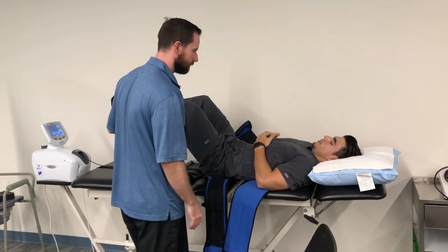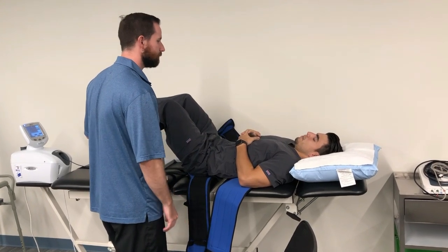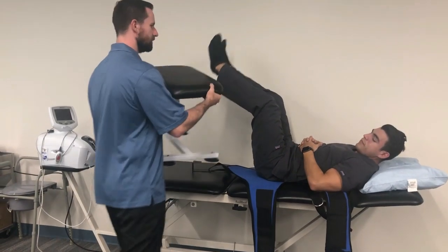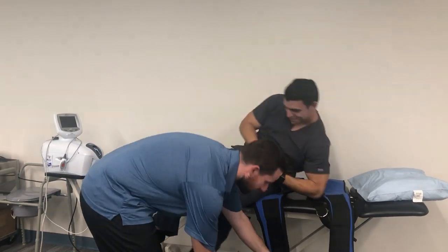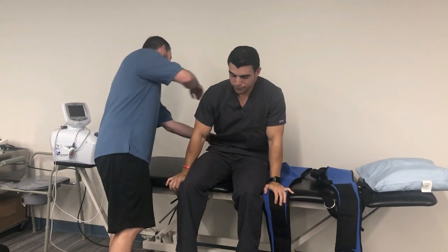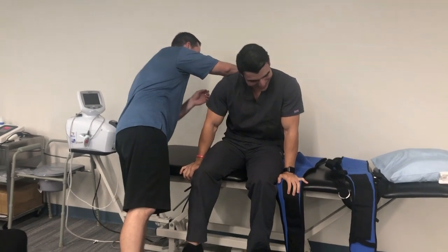All right, another 5 minutes has passed. So how are you feeling? Feeling good? Okay, so what would you say your pain level is? About a 3. Okay, so it seems like the traction treatment has helped decrease your pain some. I'm going to go ahead and move this for you. If you could please sit up for me. We're going to get started on some strengthening and endurance exercises for the lumbar spine. But beforehand, I'm just going to check the skin. Everything is intact, and there are no problems.